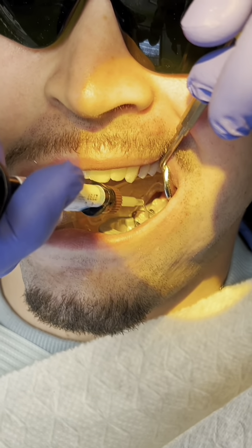With the new Bulk EZ Plus, we're also getting better wear properties and better physical properties than we had in the predecessor, the Bulk EZ. You can do multiple options with this: use it as a dentin replacement, as a total core buildup, or even take it into occlusion because of its new physical formulation. Definitely a must-have for all dentists in 2024 — Bulk EZ Plus.